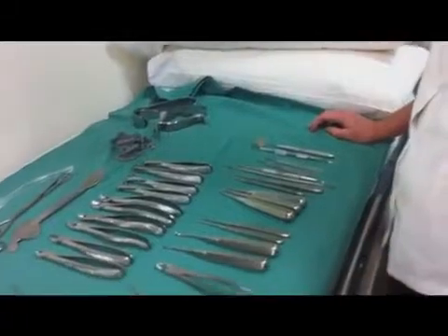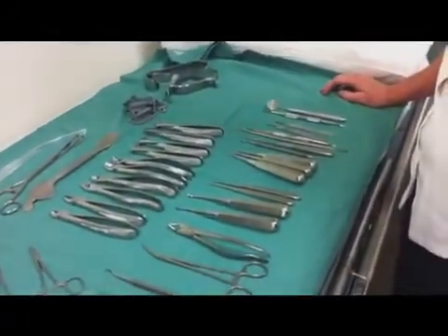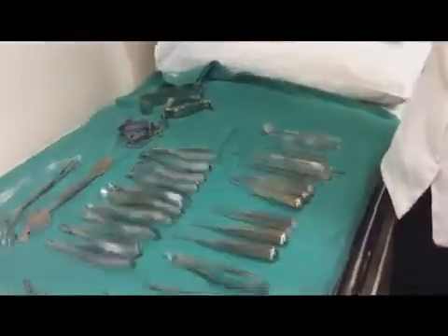Do we know what any of these things are? It doesn't matter if you don't. Do you know what these things are called? Cheek retractor? Yeah, that's a Kilner.